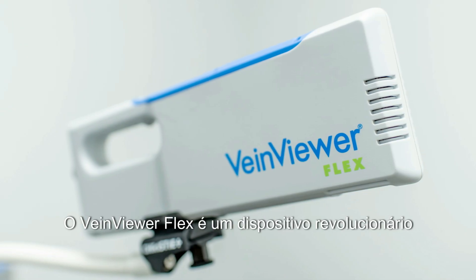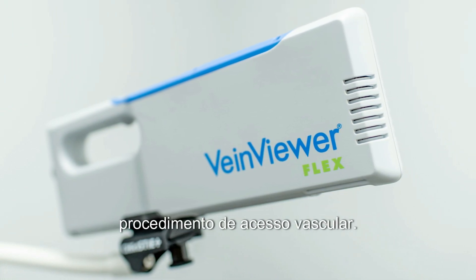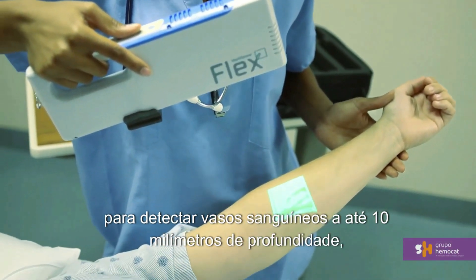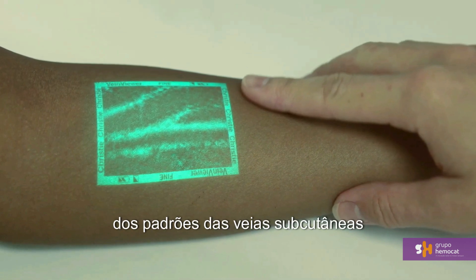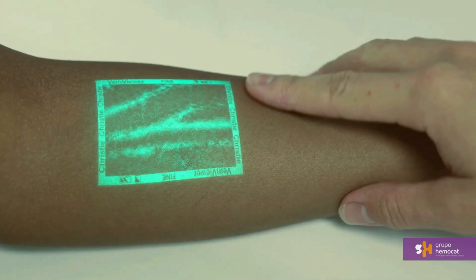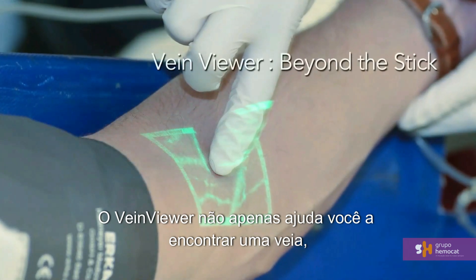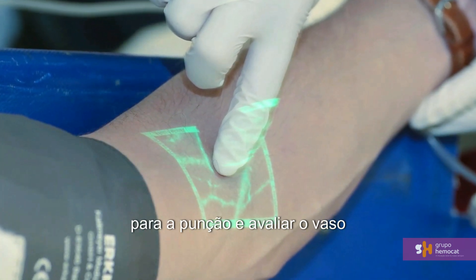VeinViewer Flex is a revolutionary device designed to assist you during the entire vascular access procedure. Using harmless near-infrared light to detect blood up to 10 millimeters deep, VeinViewer creates a real-time digital image of subcutaneous vein patterns and projects them on the surface of the skin. VeinViewer doesn't just help you find a vein — it helps you find the optimal location to stick and assess the vessel afterwards.